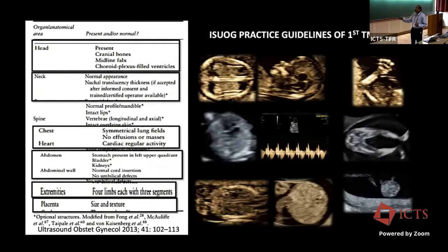That's your brainstem, and that's your 4th ventricle, and that's your cisterna magna. If this line disappears, the baby's spine is abnormal. So that is the potential. If I'm able to train a system to understand this image, then whenever the doctor does the scan, and this information is available on the ultrasound machine, it automatically recognizes that all these landmarks are present. You can tick mark and say normal. So the machine can actually start giving you information: this is a normal image. That's the potential we have.